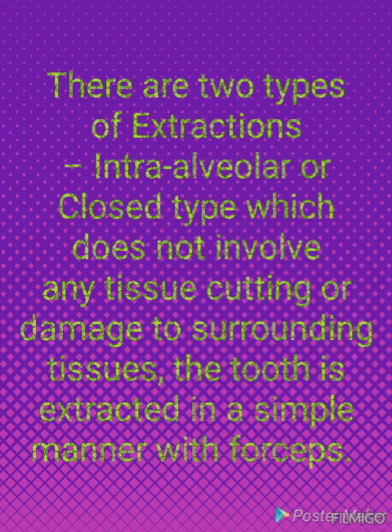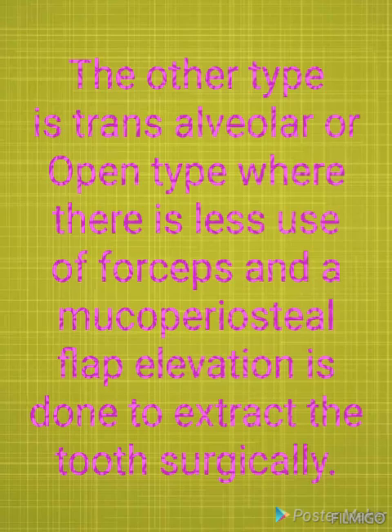There are two types of extraction. They are intra-alveolar or closed type, which does not involve any tissue cutting or damage to surrounding tissue. The tooth is extracted in a simple manner with forceps. So, a simple manner. We don't have to give any incisions or sutures. It is a simple extraction, that is intra-alveolar.